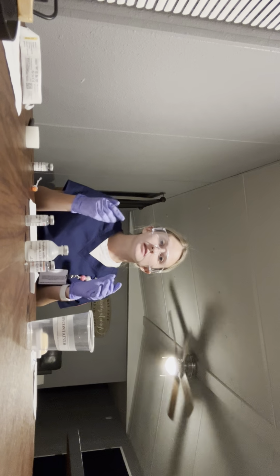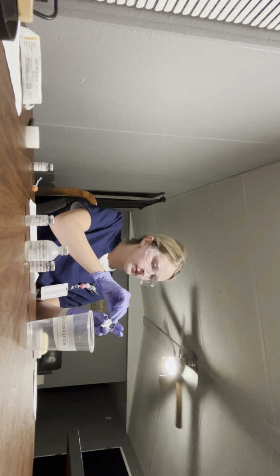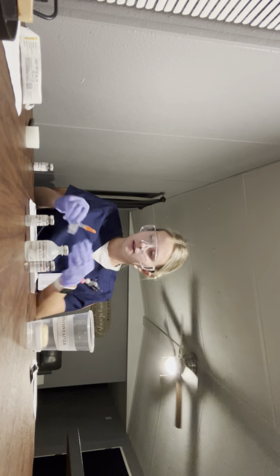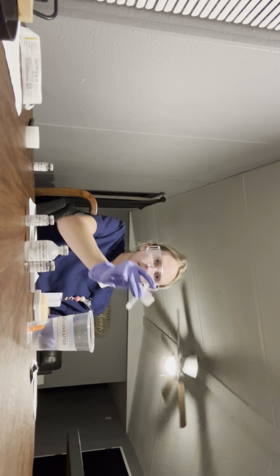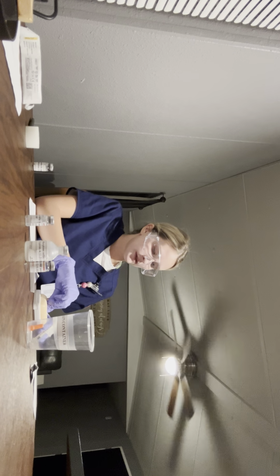So you would do this subcutaneously, so it would go to 45 or 90 degree angle, but I'm going to do it 45 because most time for insulin you give it at a 45 degree angle. So I'm going to get an alcohol prep pad. I'm going to go from inside to out, make sure I do not contaminate. Okay, I'm going to grab this. Then I'm going to pinch the skin and go at a 45 degree angle and give slow and steady. Then put this in the sharp container and then gently put pressure on the injection site.